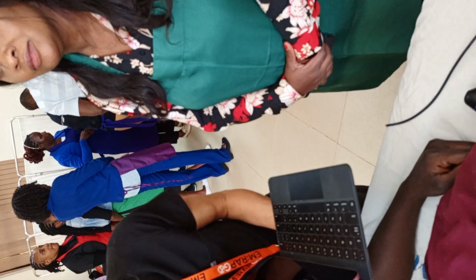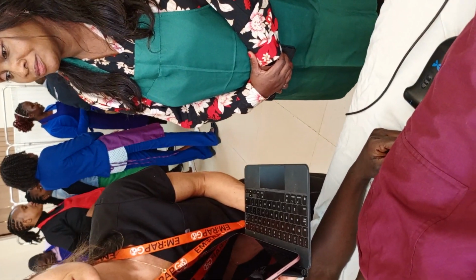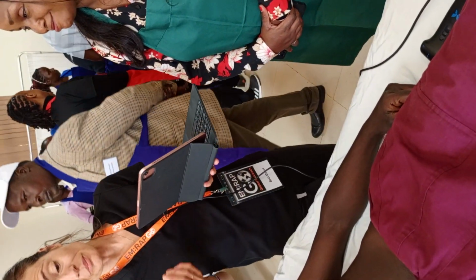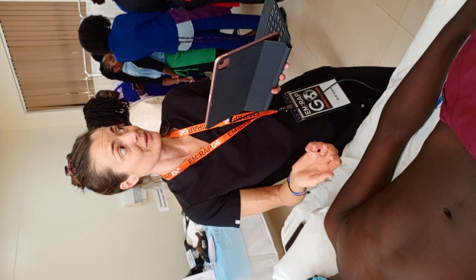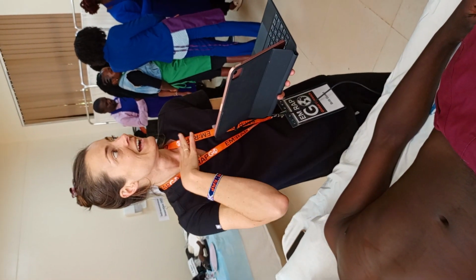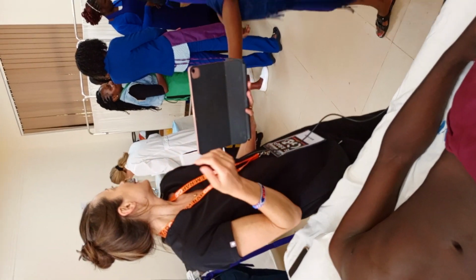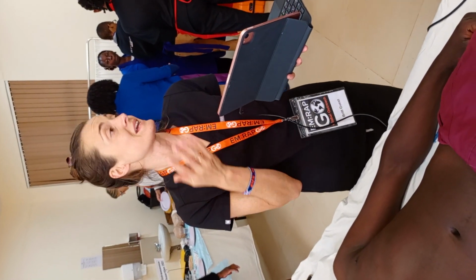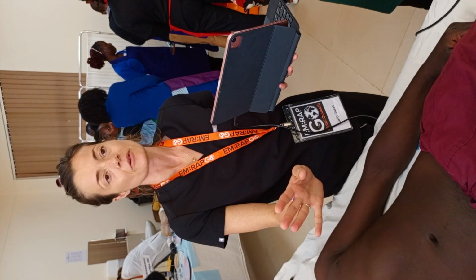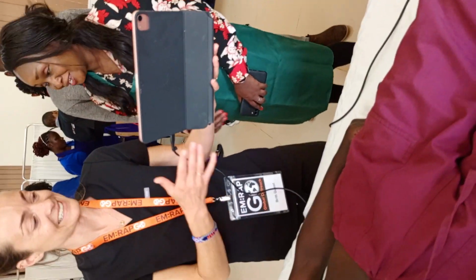Maybe one last question. In a setting where you are not able to access the ultrasound, what other mechanism will you use to confirm if there is blood there? People used to put a needle into the abdomen and do a lavage to see if blood came back. We do not practice that anymore. I would not recommend including that in your practice, but before you used FAST, did you stick needles in bellies and look for blood? We did, but not much. Mel has done it a few times. Since I've been trained, that's never been in practice. Thank you. I don't suggest it. Okay, thank you.